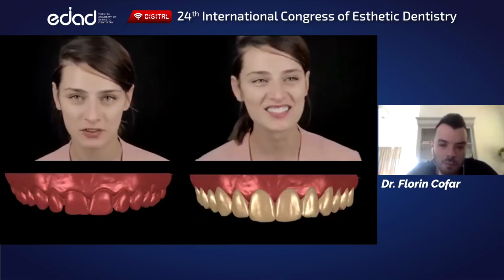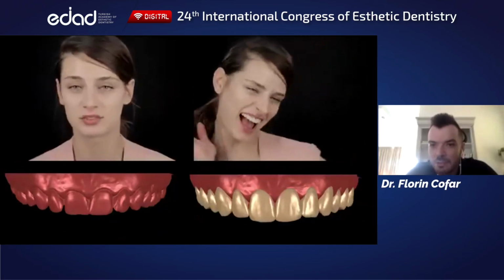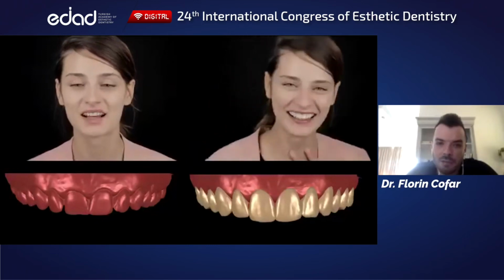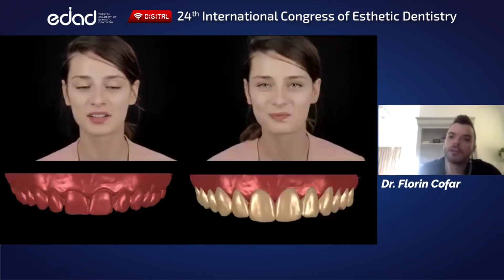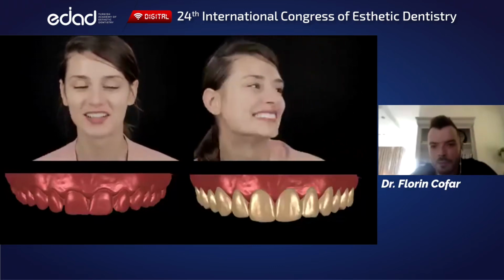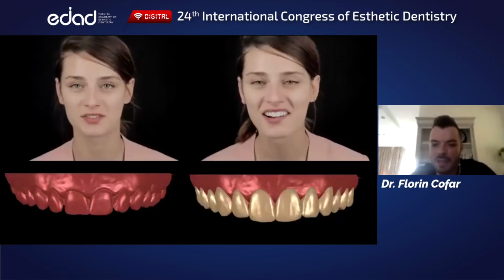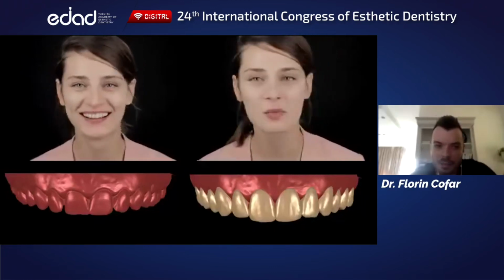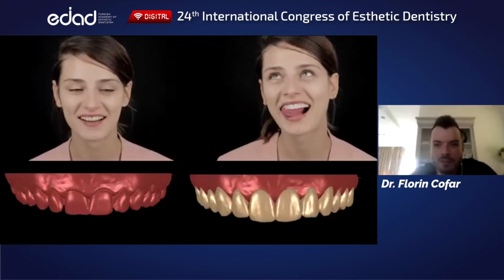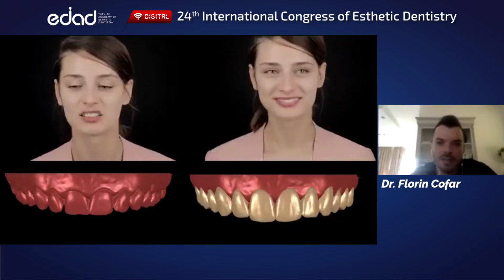Why? Because this mockup, being always on top of existing teeth and tissue, is not really accurate in all 3 dimensions. It's actually accurate in 2 dimensions, horizontal and vertical, because in terms of sagittal, it's always bulking out. The more protrusive the case is, the less accurate this step is. In reality, this design is precise only when you have a pure additive case, which is not really the average day scenario.